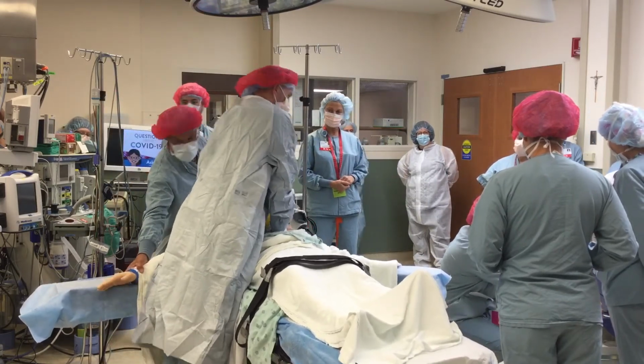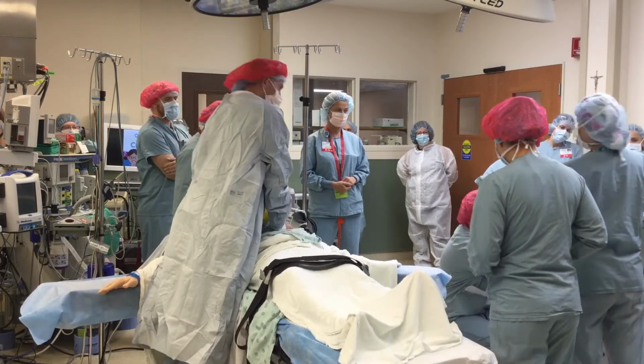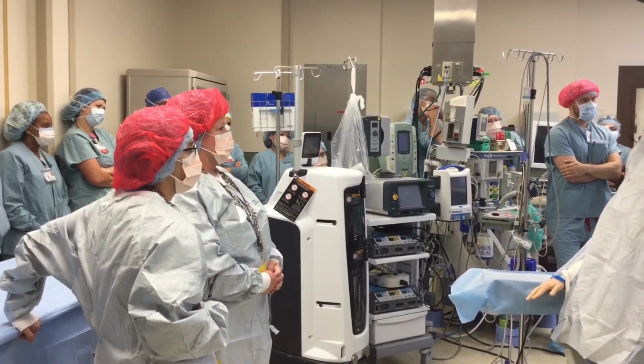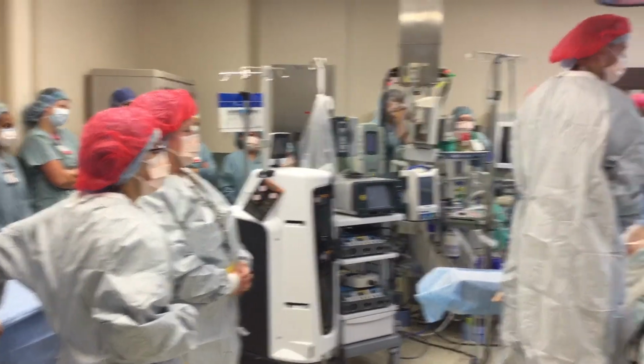All right, let's charge again, and let's defibrillate again. Okay, and you want to charge it 300? 300. Okay, charging. There's no outline stuff, you'll have to call anesthesia or run to get them. Ready? Everybody all clear? Pushing the button.